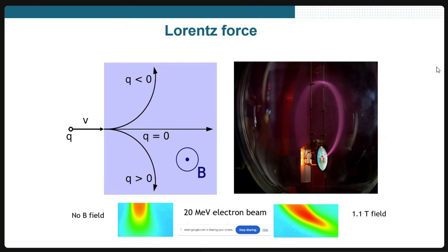When the high energy photon hits the patient, inside the patient the delivery is through electrons, because the photon transfers all its energy to the electrons, and the electrons get the energy, travel some distance in the patient's body, and then deliver the dose at a particular point. So when the electrons are generated, the Lorentz force can act on them. So that also has to be incorporated.